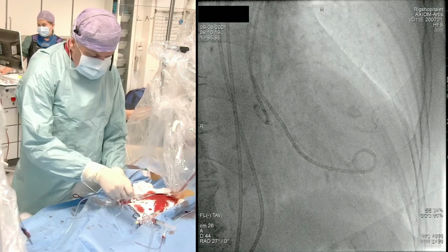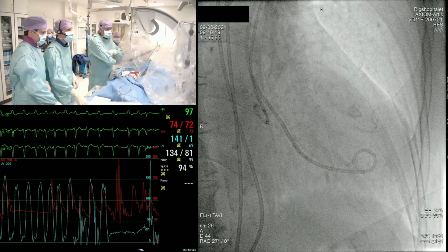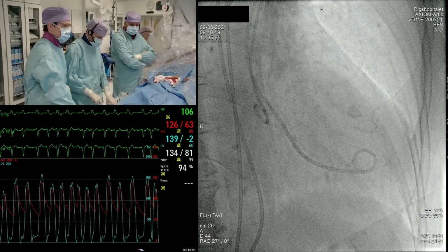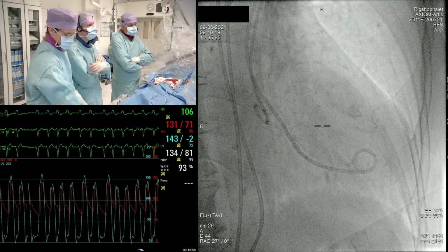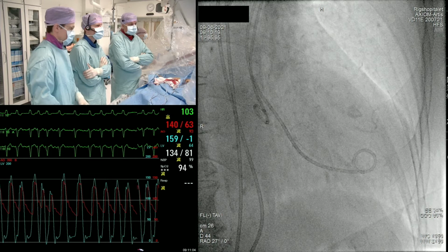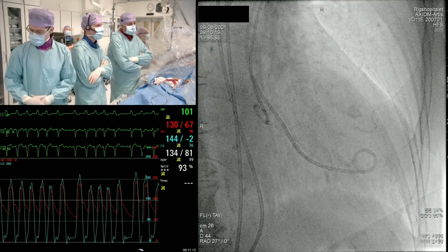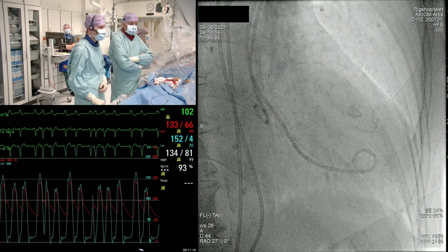So I'll do some hemodynamics, and maybe you can explain what we can use those for. Again, remember this was a patient with low flow, low gradient. Exactly. So what we are mostly interested in before TAVI also here, so we see there is a gradient, and then we look mostly at the end diastolic pressures also. So in the LV, the end diastolic pressure is here around 16, and then in the aorta, it's 74. So we look at these end diastolic pressures and the separation between these two curves end diastolically to compare before and after TAVI to have some additional assessment of PVL or not.